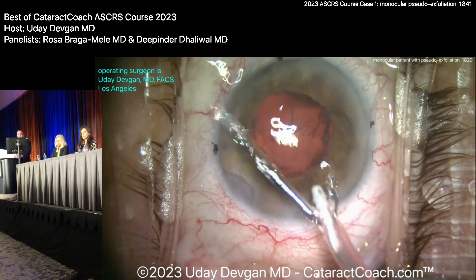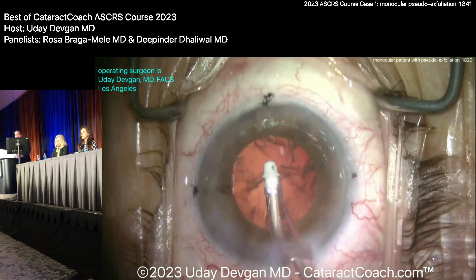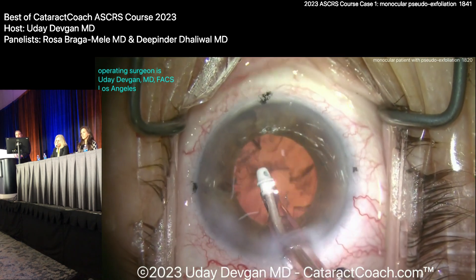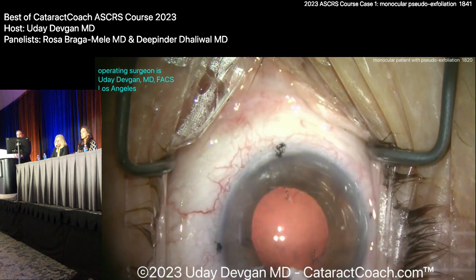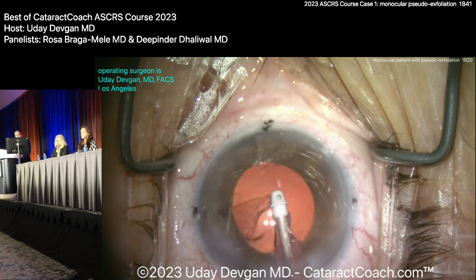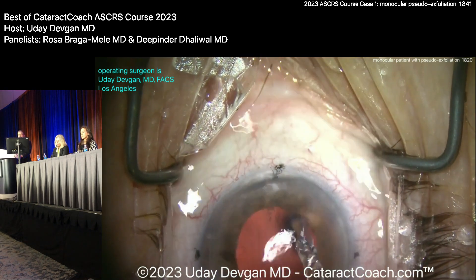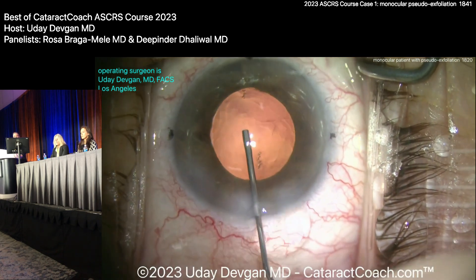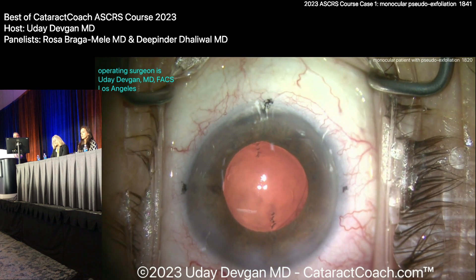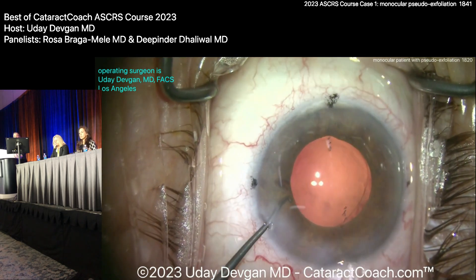Now, what Rosa said earlier was a great point: watch the rhexis edge. If you're doing cortex removal and you see the rhexis moving — oh, that's badness. Luckily the rhexis is not moving. I have marks on the cornea at about 11 degrees, which is the steep meridian — against-the-rule astigmatism. Filling up the bag looks pretty reasonable. At this point I want to put a CTR in. 100% agree. Absolutely — especially with that toric lens.